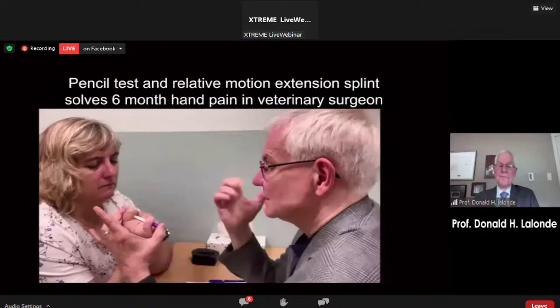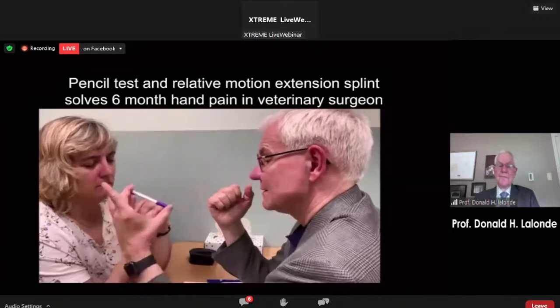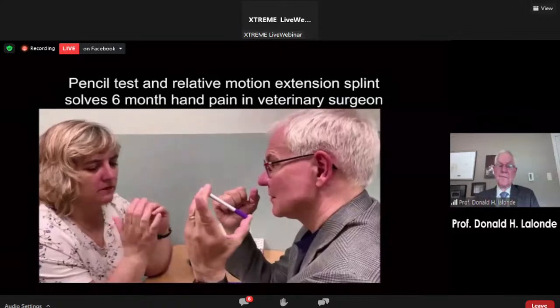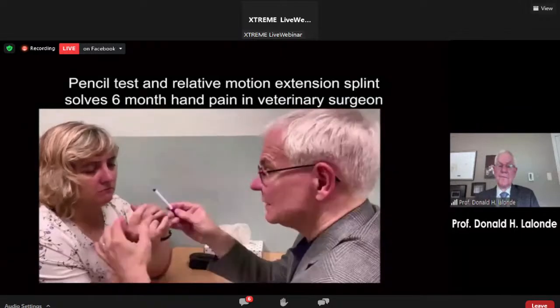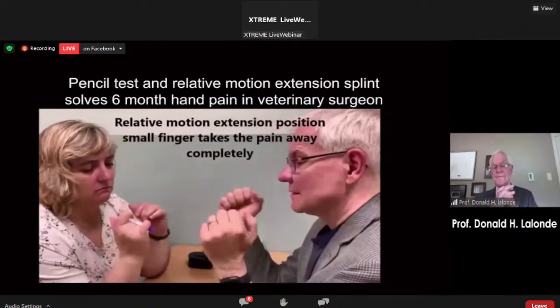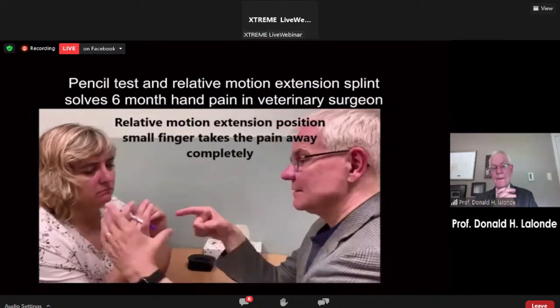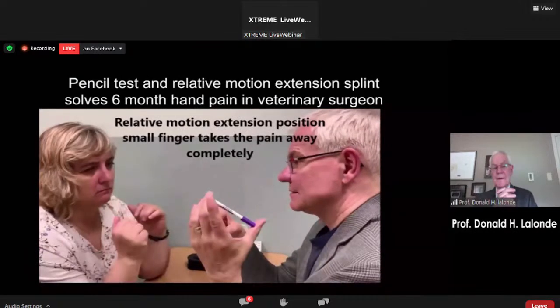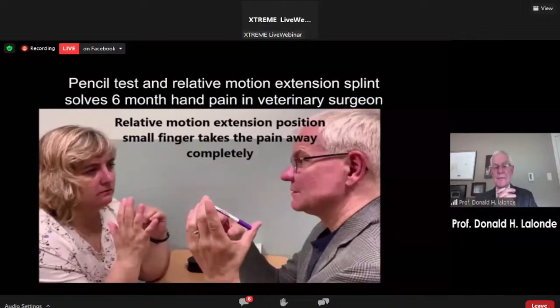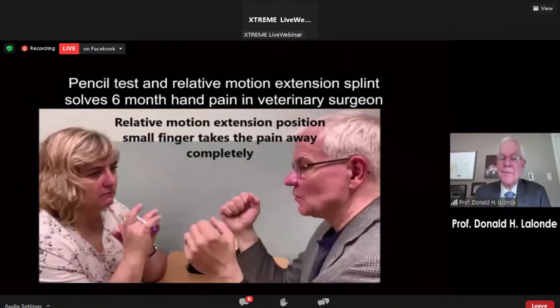Does that hurt more than this, or is it the same? It doesn't hurt at all when you did that. It didn't hurt at all when we did that. Let's try that again. So right now, that's feeling better like that than it is like this. Yes. Now it's starting to hurt. Okay, let's put that back in there for just a minute. And we're going to talk while you're moving it a little bit.